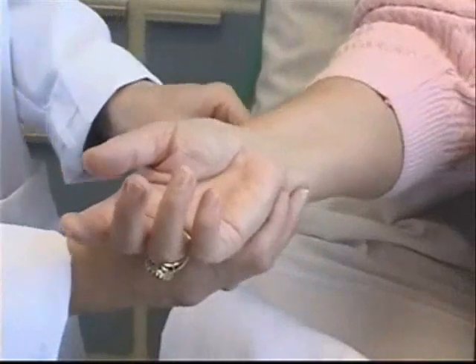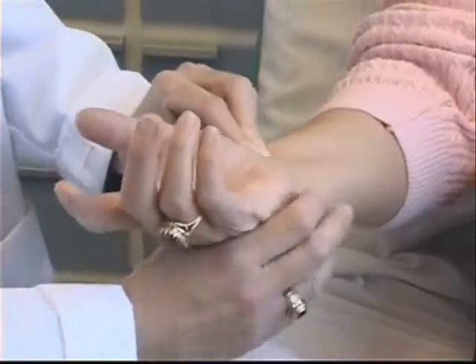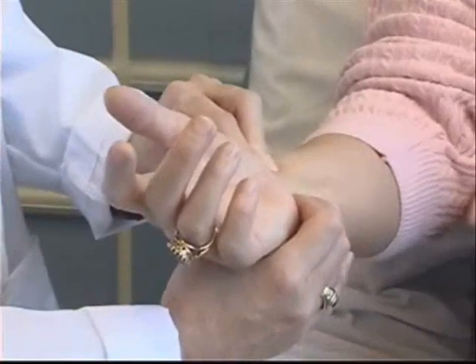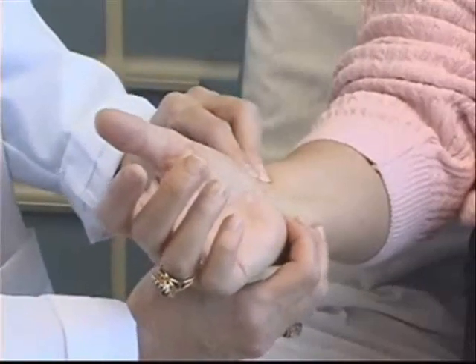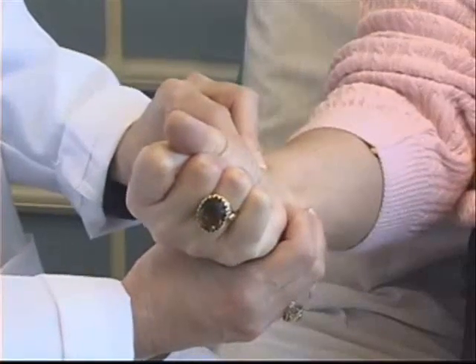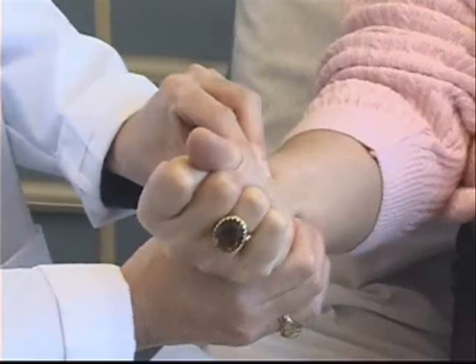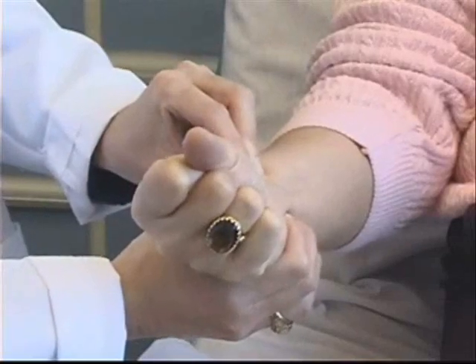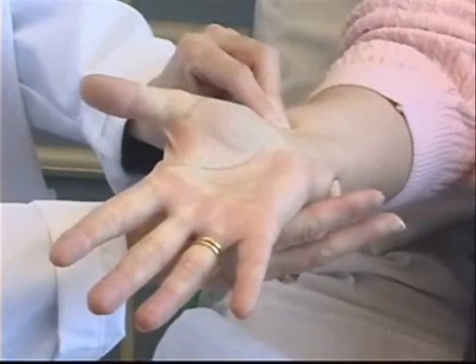The Allen's test is performed as follows. First, I'm going to palpate the radial artery with my fingers. Next, I'm going to palpate the ulnar artery. If I can't feel the ulnar artery, I'm going to palpate the area closest to where I think it would be located. I'm now going to ask my patient to make a fist as tight as she can and maintain that position for approximately 10 seconds, while I occlude both the radial and the ulnar artery. After enough time has elapsed, I can ask my patient to release her fist, and I can release my grasp on the ulnar artery.